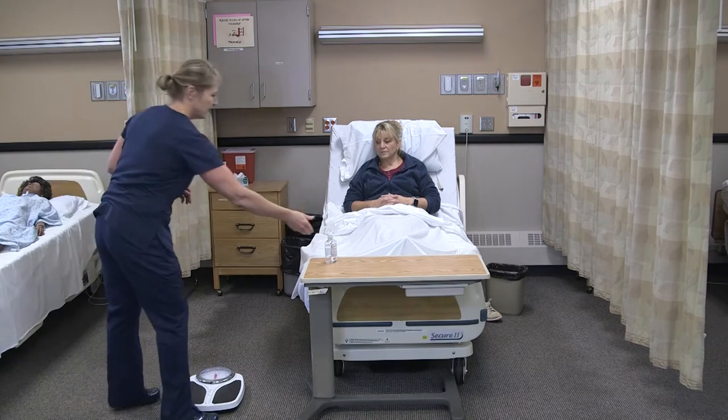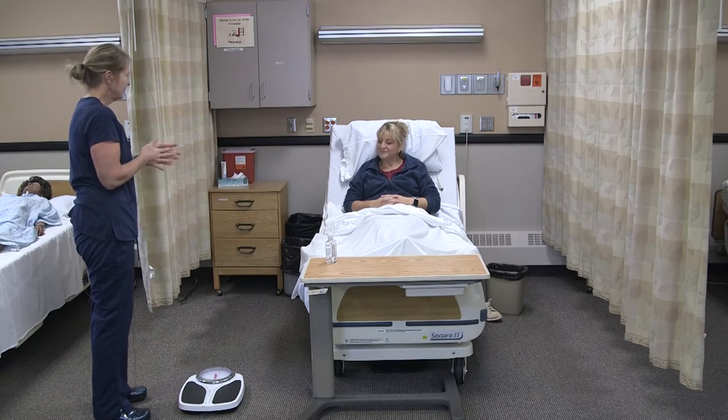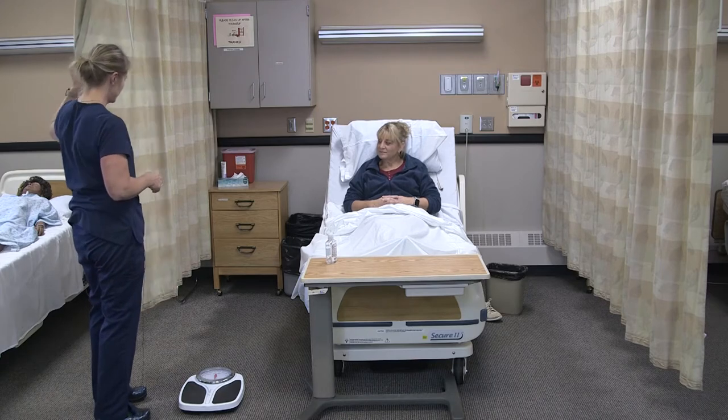I'm going to knock on the door and wash my hands. Annie, I'm Myra. I'm here to take your weight — is that okay? I'm going to provide for privacy.